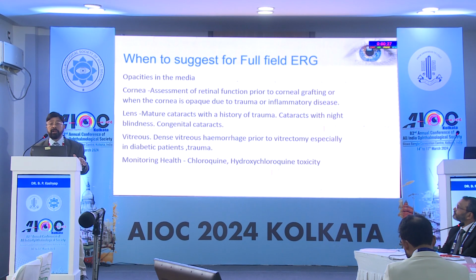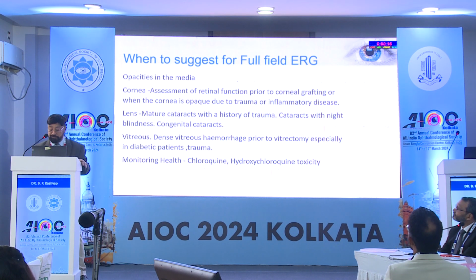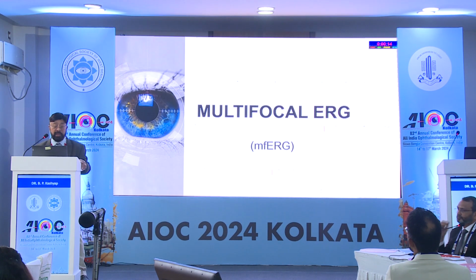Especially nowadays, a lot of people are going for hydroxychloroquine and chloroquine for different diseases, even arthritis patients are taking it, and the patient says that he is not seeing anything. So you have to go for a full field ERG and multifocal ERG.